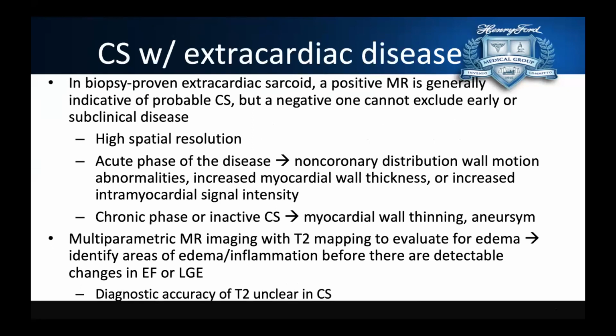And then moving on to our advanced imaging techniques. Cardiac magnetic resonance, or CMR, is a non-invasive advanced imaging test, right? It offers high spatial resolution. You can see detailed assessment of our left ventricular and right ventricular function. You can see if there's edema, perfusion defects, myocardial scar. Again, it offers high spatial resolution.